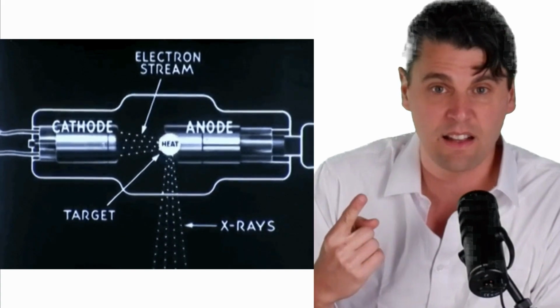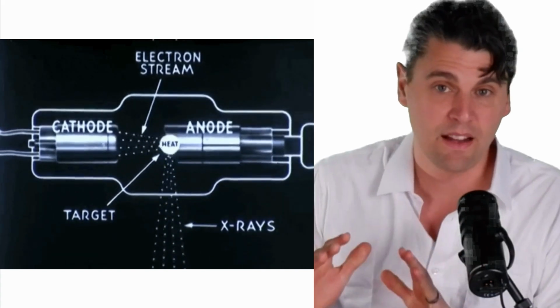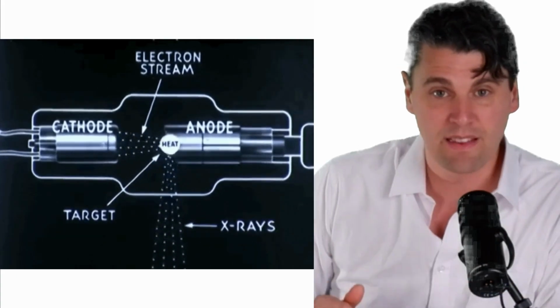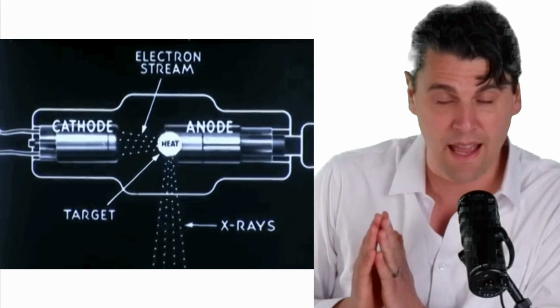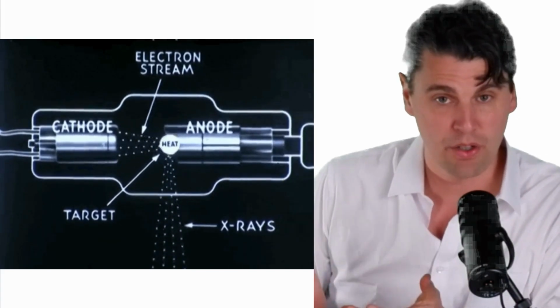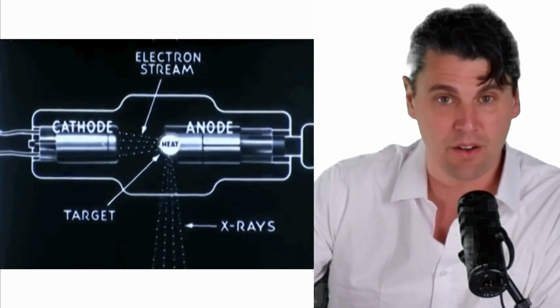How long is the X-ray tube going to be on? And when the X-ray tube is on, what's the potential, the kVp, across it? And what's the tube current? The milliamperes is the tube current, and the tube current is directly proportional to how many X-ray photons are going to be generated.